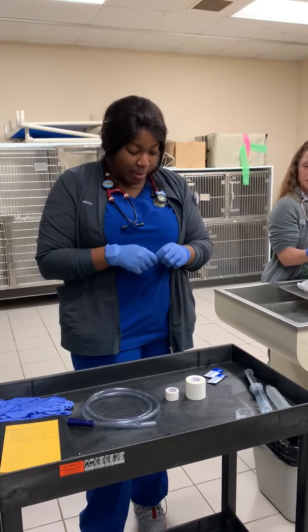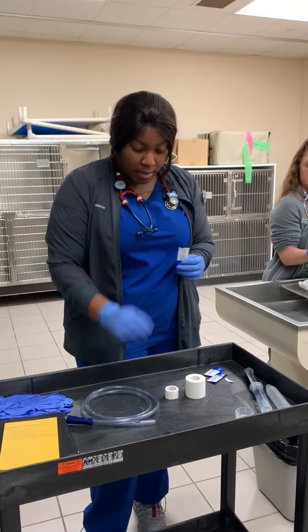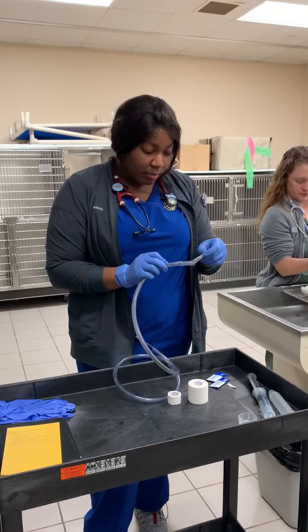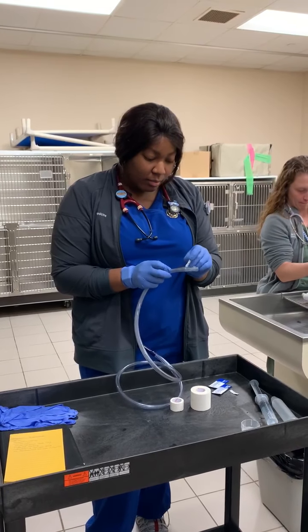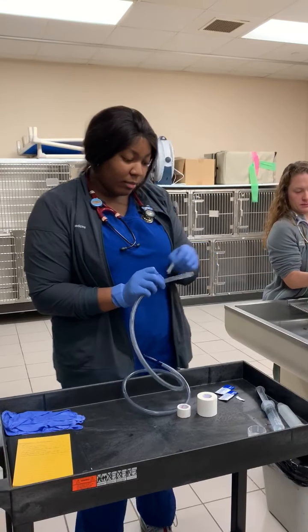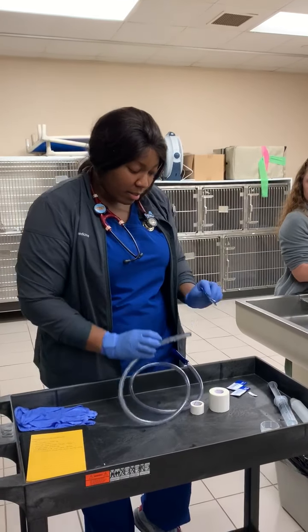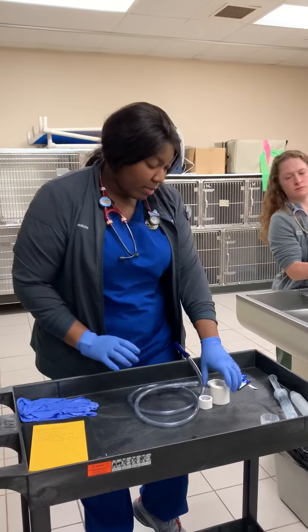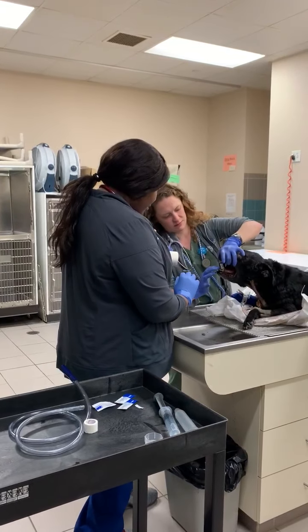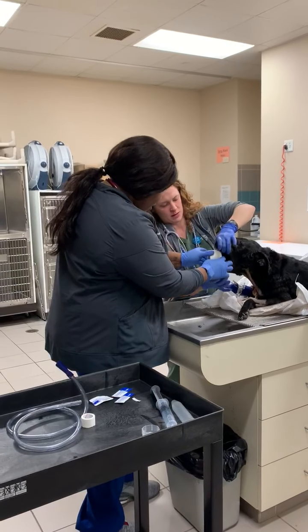So we want to make sure we first get everything looped up as much as we can. And I'm going to get my mouth speculum that I'm going to use. Use this to hold it open.